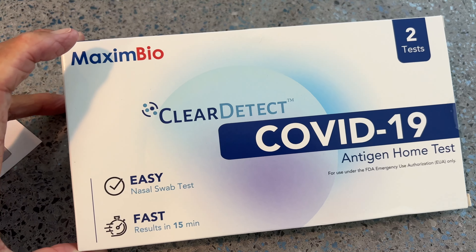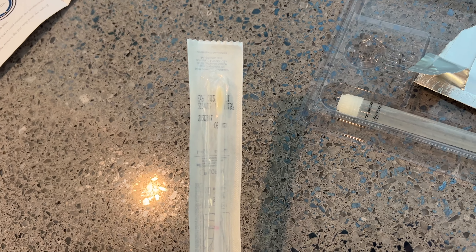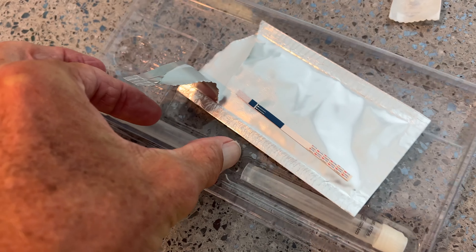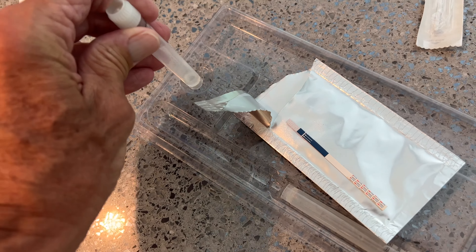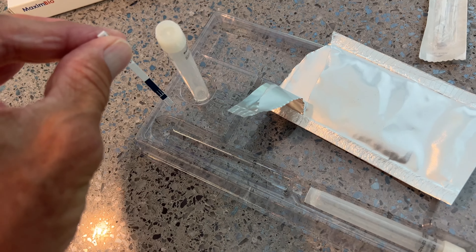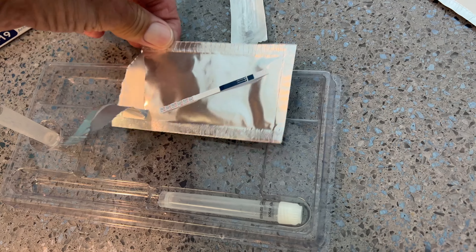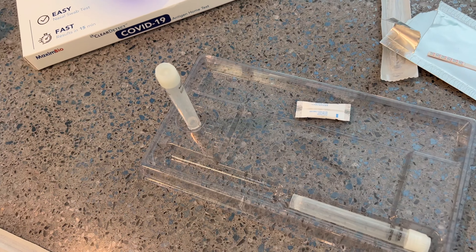All right, so we got this one. It's called Maxim Bio, and this is completely different. So you get the swab, you got to swab your nose like 10 times both ways in each nostril. You get one of these doohickeys here, and what you do is push it in this little thing there, and they give you this tab — you hold it from this side and drop it in there. What's interesting is when you put the swab in, you break the swab off and leave it inside of that thing, which is weird. But let's give it a try and see how it works.